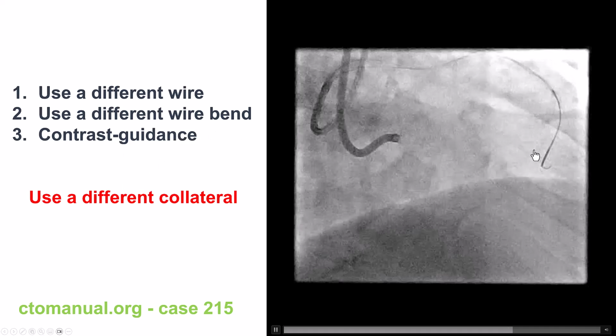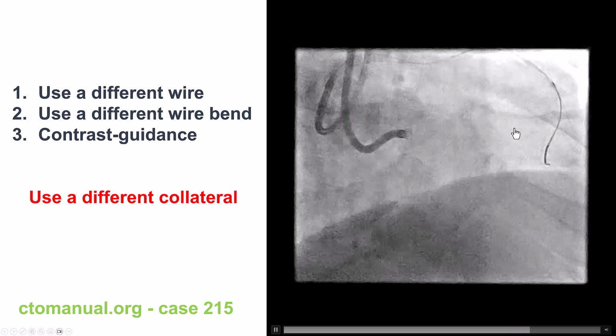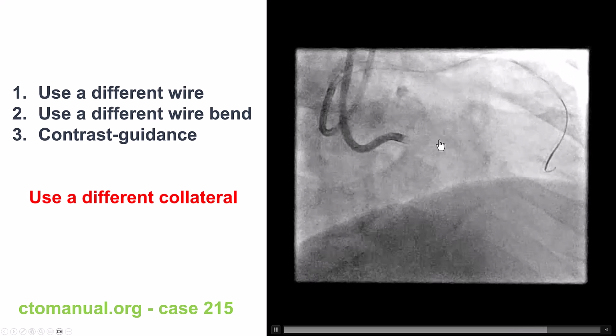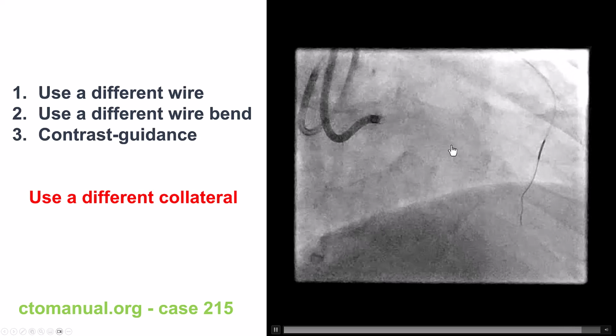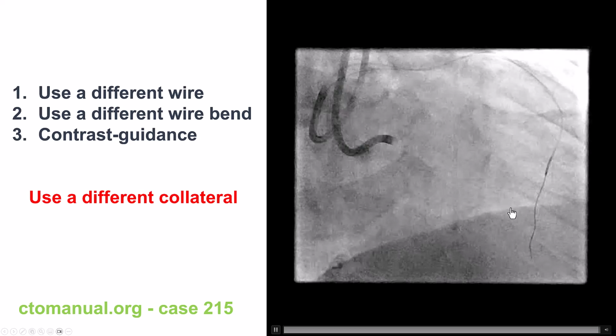Be careful when injecting after doing surfing, because if the wire has gone out, there's a possibility that there may be some leaking, some small microperforations of the septal that may enlarge with forceful injection through the collateral.